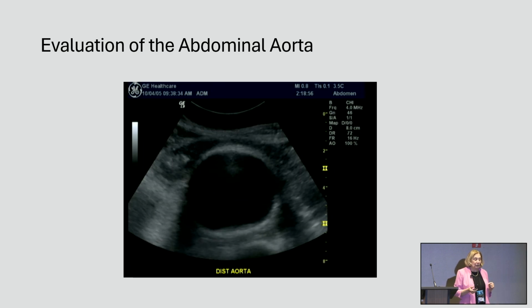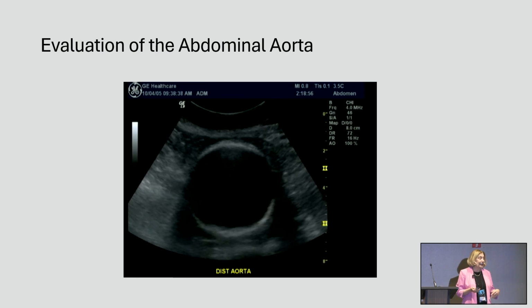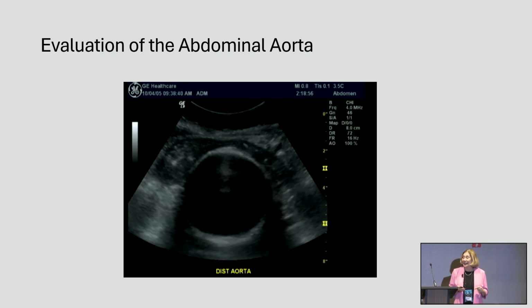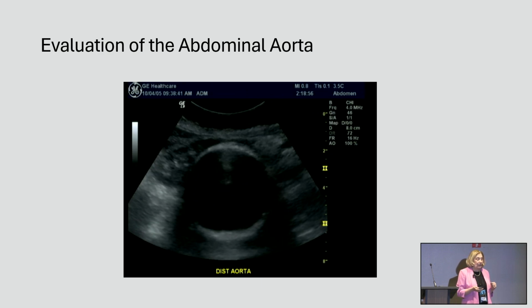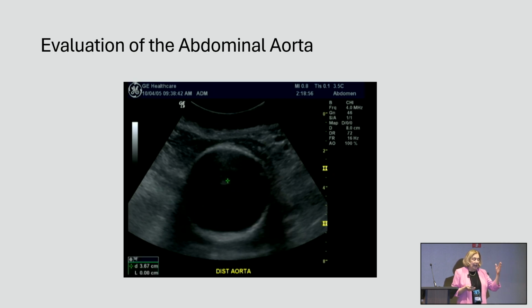So as you're searching through the abdomen, this is typical. We're looking at what looks like an aneurysm. Everyone agree? It looks pretty big. Now let's find the best spot. We circle around, we cine loop back, and then we start placing our cursors, outer wall to outer wall, AP and transverse. This looks like a pretty good circle to me, so those measurements shouldn't be very different.